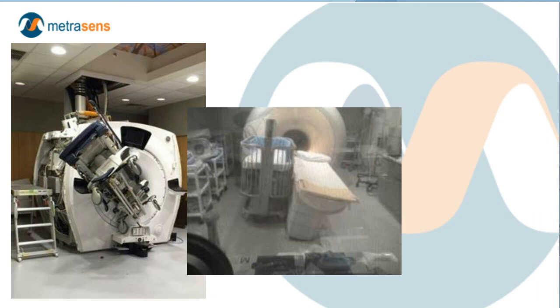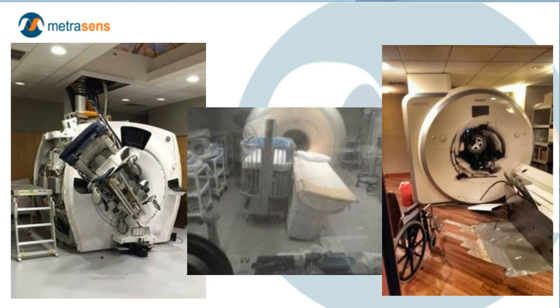This also, as you notice, the actual table that's mounted on the floor here is kind of listing to the right. Not only do we have the concerns about the patient, the infant in this case, but also damage to the equipment. Similar set of concerns and considerations. This one we're going to ask about the patient mix. And while we may think generally about MRI patients as adults, what does it mean when it's a pediatric population, or a geriatric, or a bariatric population? Or what does it mean when we have a disabled person?